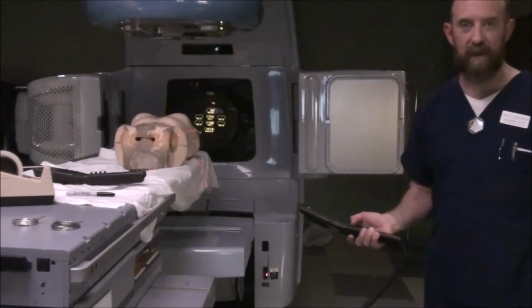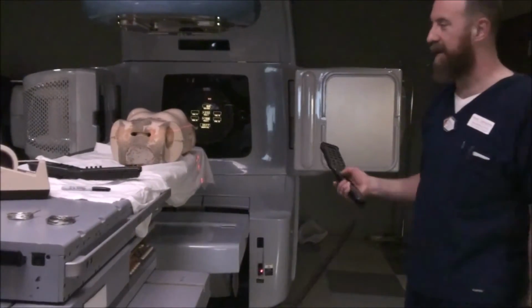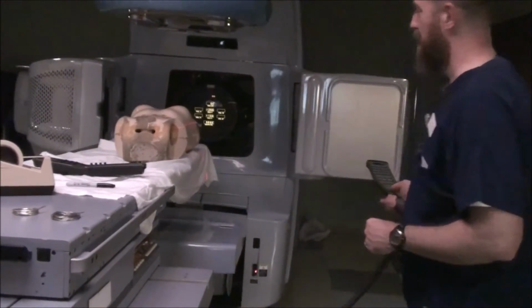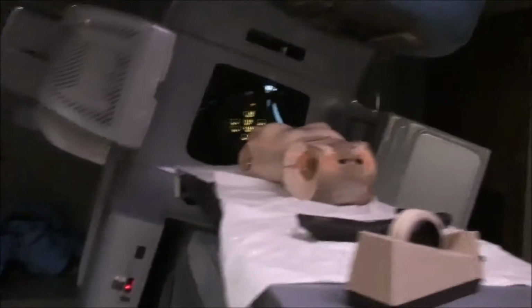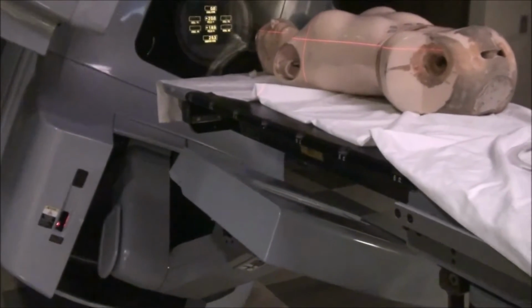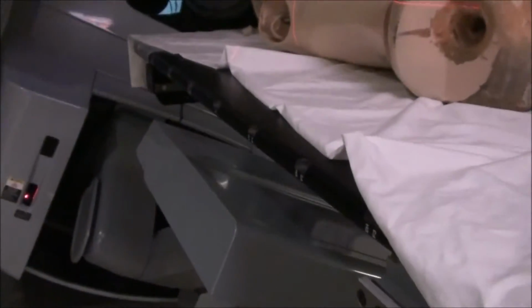Since you wrote down what that gantry angle is, you're golden. I didn't do that. I can't remember where I was. But I'm going to demonstrate what you don't want to do. As you come around, just like with other things, guess what? We've got a problem. You could ruin the equipment.